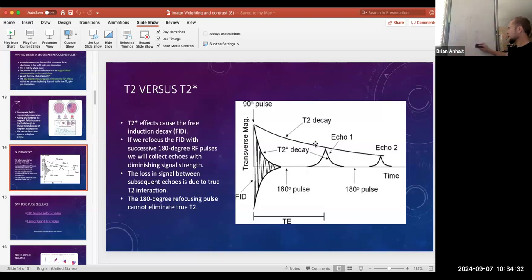That makes sense. Yeah, that's why the models typically look more like this, like a spin echo model. And then we're going to wait a long time. I don't have enough room on my board before we actually transmit the 90 again. So we're going to have full loss of transverse magnetization before we do that again. And then it's going to be the 90 pushing more longitudinal magnetization into the transverse plane and not refocusing any transverse magnetization.